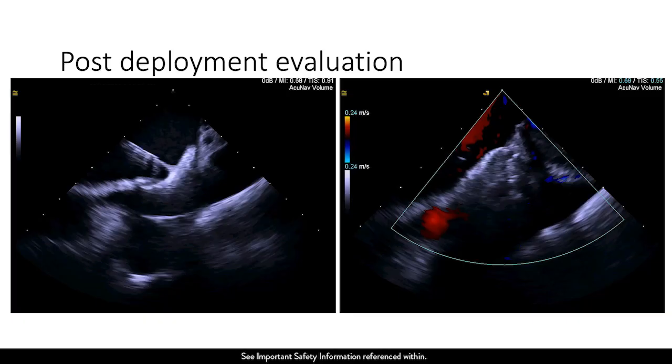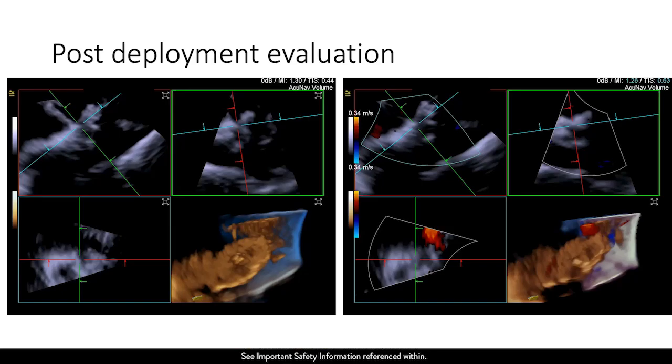And these are the final pictures as it sits, and then you can do your color. And this is the release, as you see. You can see that there is no leak whatsoever in this case, and the device has been released. Final pictures we took using the 3D as well, where you can see, again, a nice figure of 8 over there, and post-deployment evaluation.